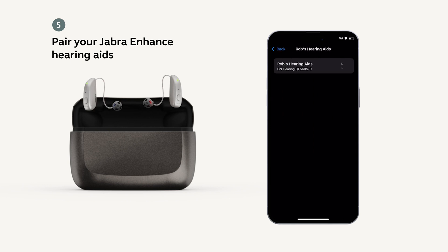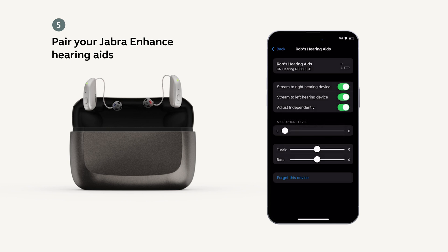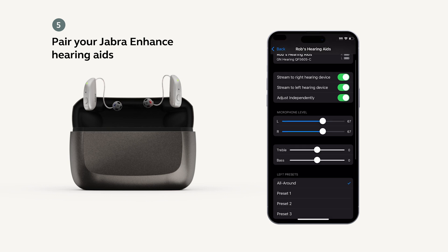Tap the name of your hearing aids, then select Pair twice. Make sure both left and right appear. Stay on this screen for a minute or two to allow the presets to fully load.